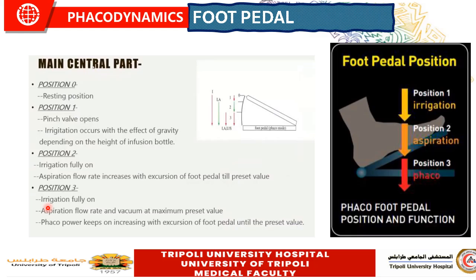However, if you program your ultrasound delivery as a panel mode, the preset value of the ultrasound will be executed once you press down to position 3, and the whole energy will be reached once you press in position 3, regardless of whether you further increase the pedal. So there will be no linear control. The whole amount of the preset value will be executed once you reach position 3.